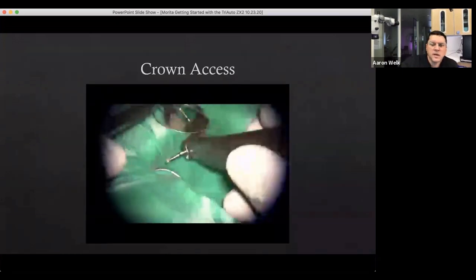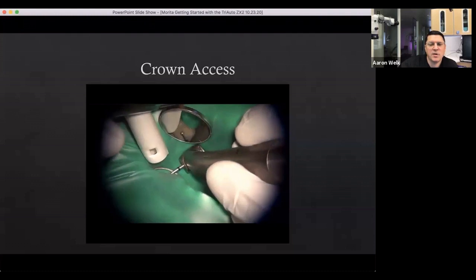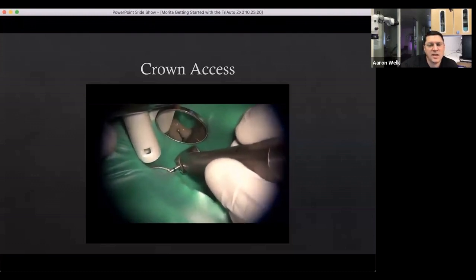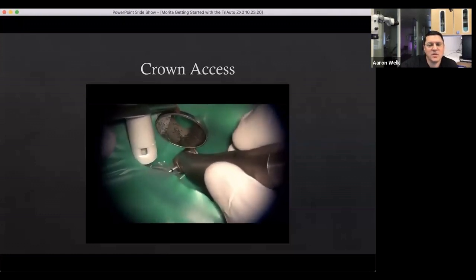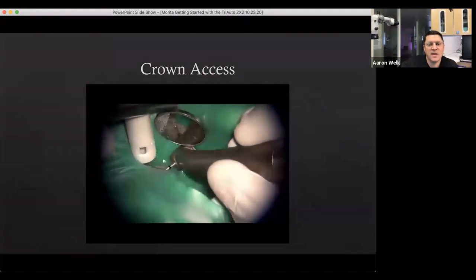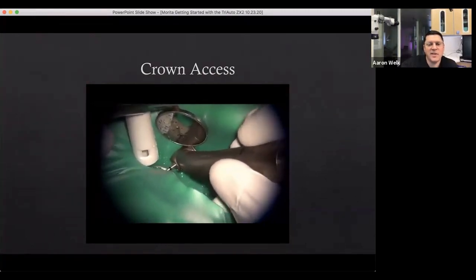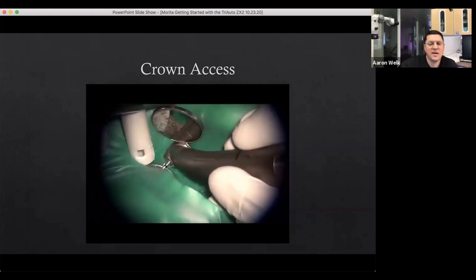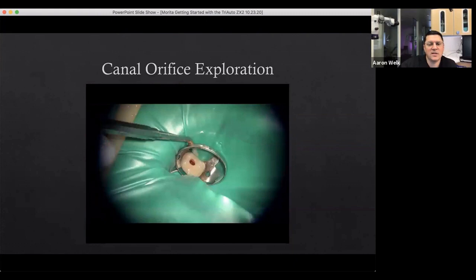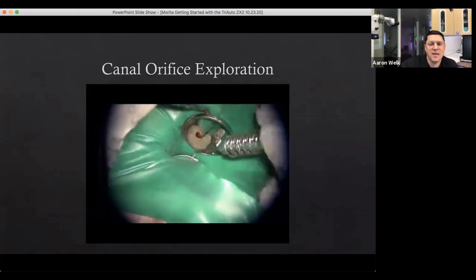Access is made using a zirconia burr. I like to use Agendo — they make a great zirconia burr, it's cheap and efficient, two of my favorite things. It does a really good job working through lithium disilicate, zirconia, and just about any of the ceramics out there, even porcelains.